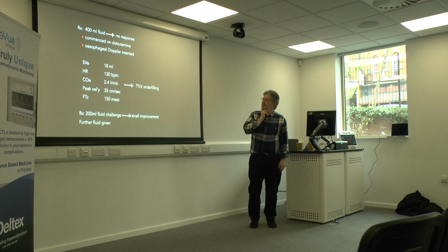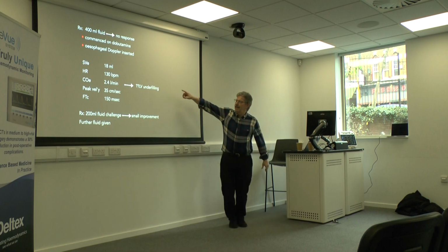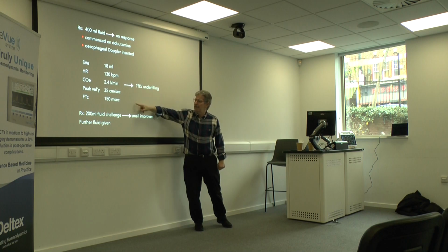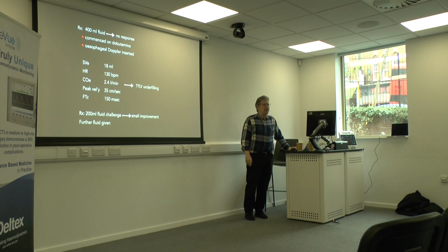The resident tried some fluid challenges, no response. Someone had literally just arrived. He'd been on a low dose of dobutamine. I put a Doppler in, and he had an 18 ml stroke volume, was tachycardic, looked empty, corrected flow time of 150. Boom. So I thought, look, try a fluid challenge. And it got better. Not hugely, but it did get better. So let's repeat the challenge, repeat. Nobody else was going for fluid, so that's what we did.